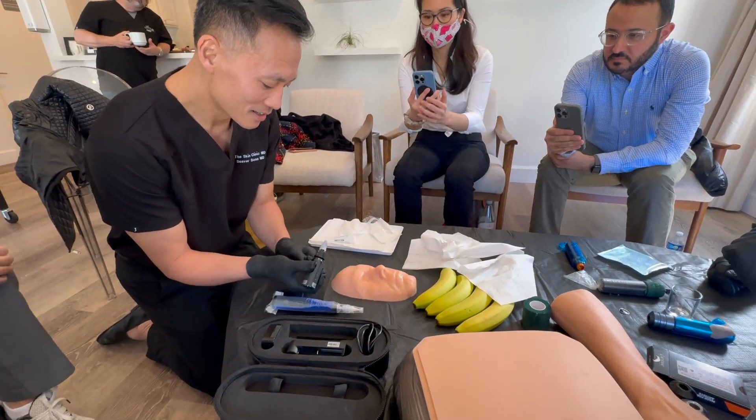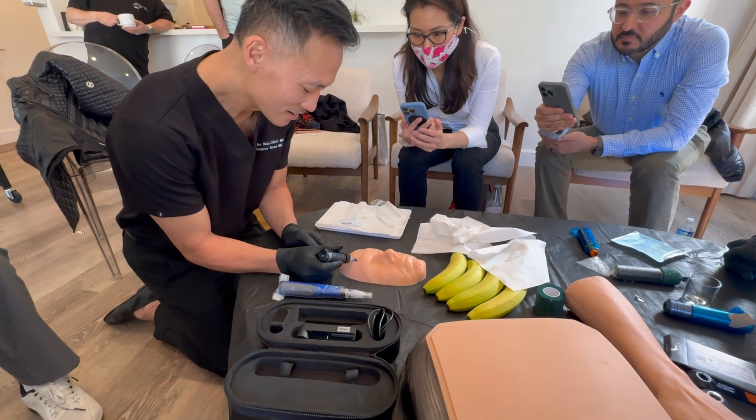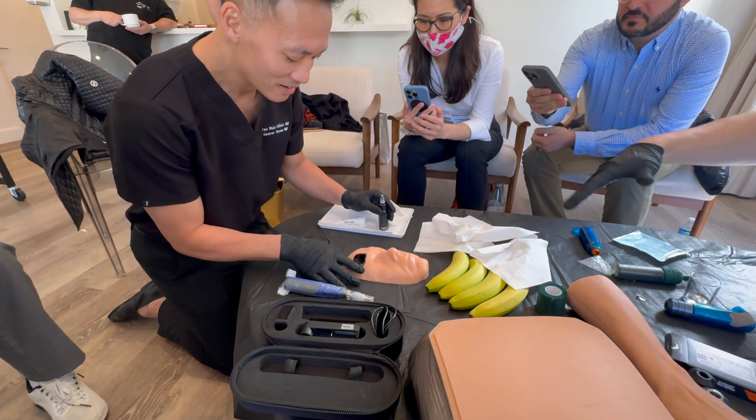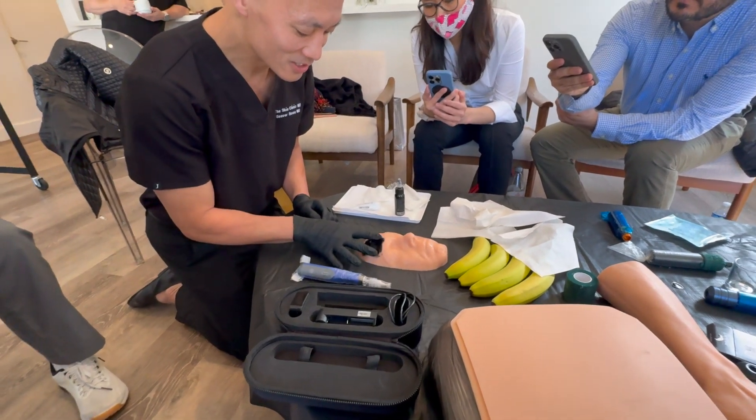I'm going to do the red side. Use twos. And it's black ink, so be careful with the amount. If you use more with the PRP, you can use more. I just use a little bit.